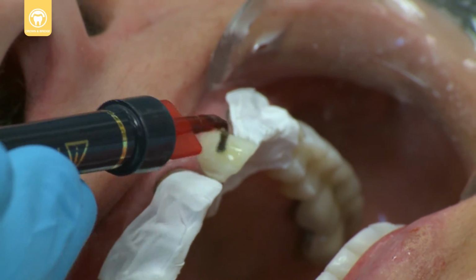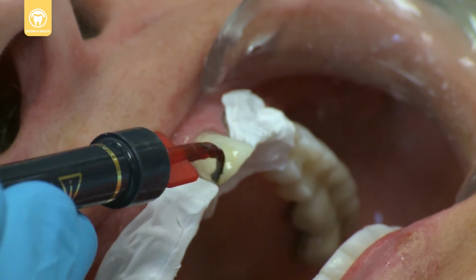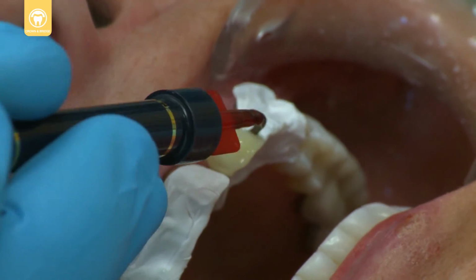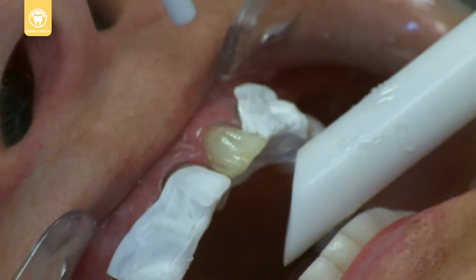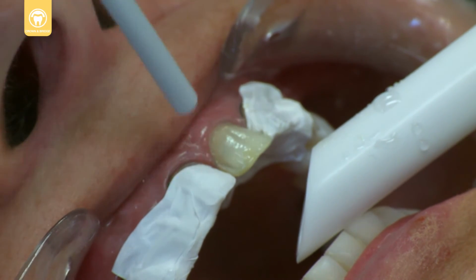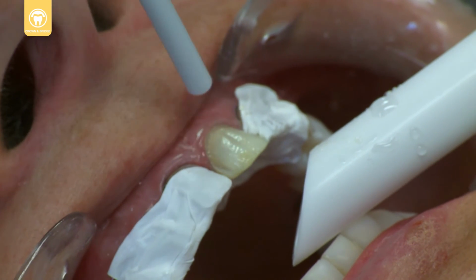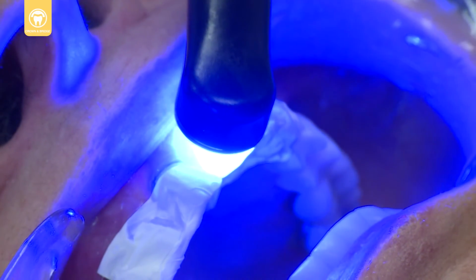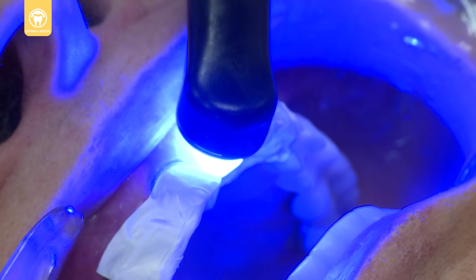Apply a puddle coat of Peak Universal Bond with the Inspiral brush tip and gently agitate it into the surface for 10 seconds. Thin and dry for 10 seconds using full air pressure. The preparation should appear shiny. Light cure the preparation with the Velo curing light for 10 seconds on standard mode.